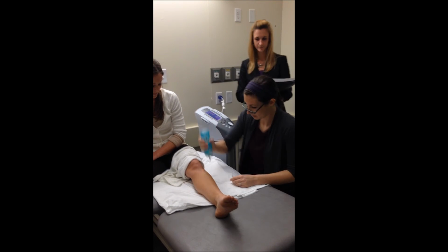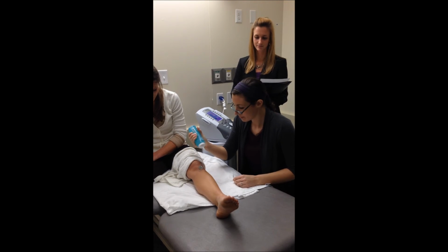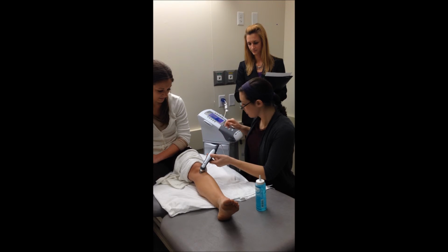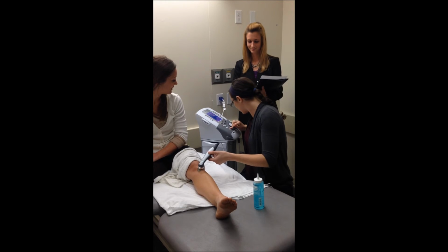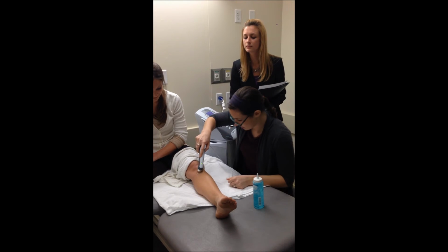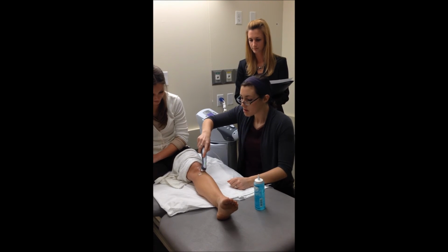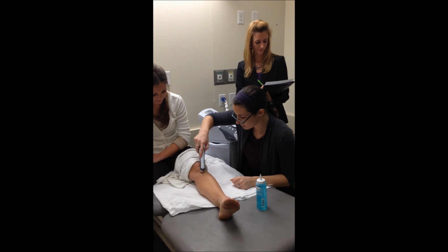Make sure it's good and gelled. Nice work. And where's start? Here. Oh, the green light turned on. I think that means it's good to go. And I'm going to make sure there's lots of gel underneath this head. And I'm just going to keep moving it around in little baby circles.